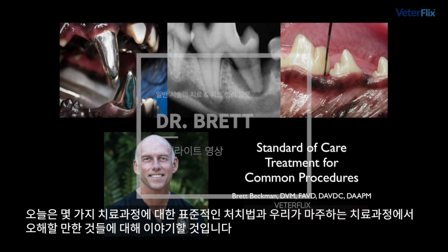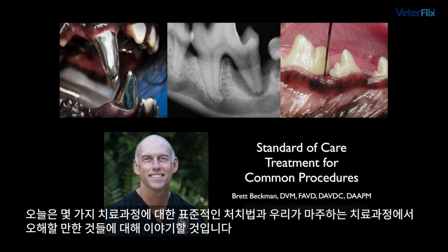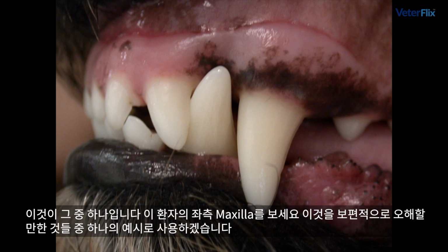I'd like to share with you now the standard of care treatment for some common procedures and also address some misconceptions we have about some of the common procedures that we encounter. This is one of those. Take a look at this left maxilla on this patient, and we're going to use this as an example of one of the common misconceptions.